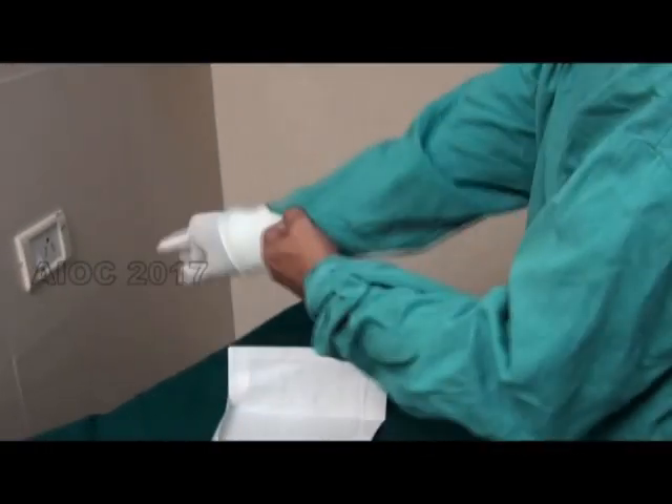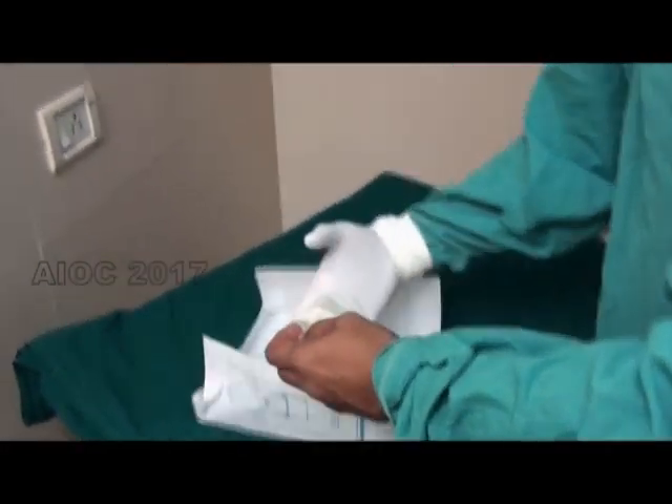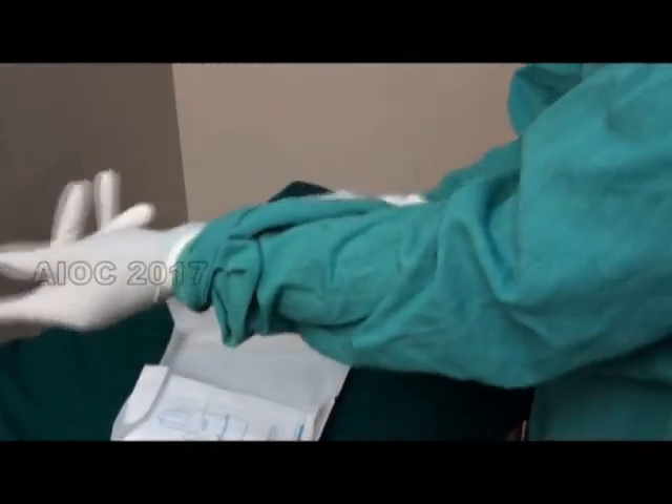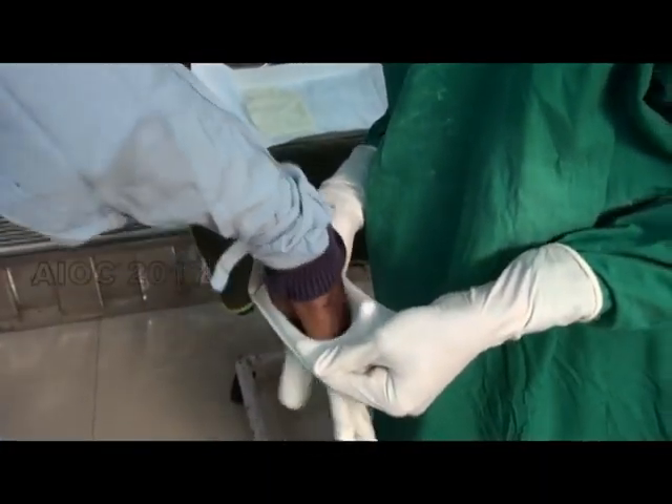The proper method to wear the glove is being demonstrated here. The exterior of the glove is untouched by the bare hand. This is also the assisted way of wearing the glove.